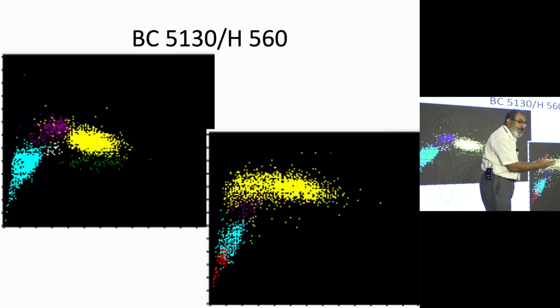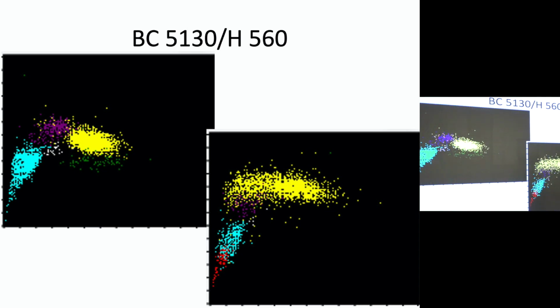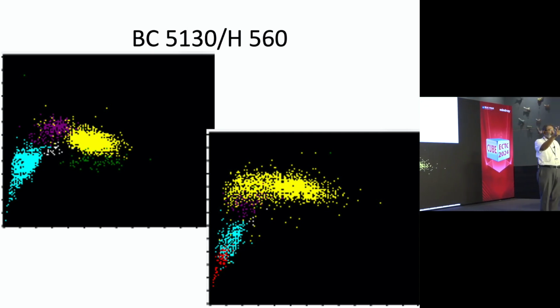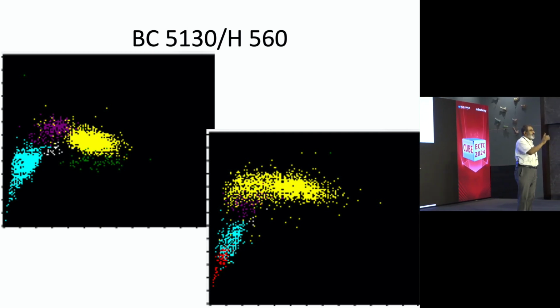So even a simple cell counter can identify sepsis. See, look at those neutrophils. They are large, they have low scatter, and they become larger than monocytes. And it's also causing pseudomonocytosis. So whenever a cell counter gives you pseudomonocytosis, pseudoeosinophilia, pseudobasophilia, don't blame the cell counter. The cell counter is telling you that there is something abnormal.